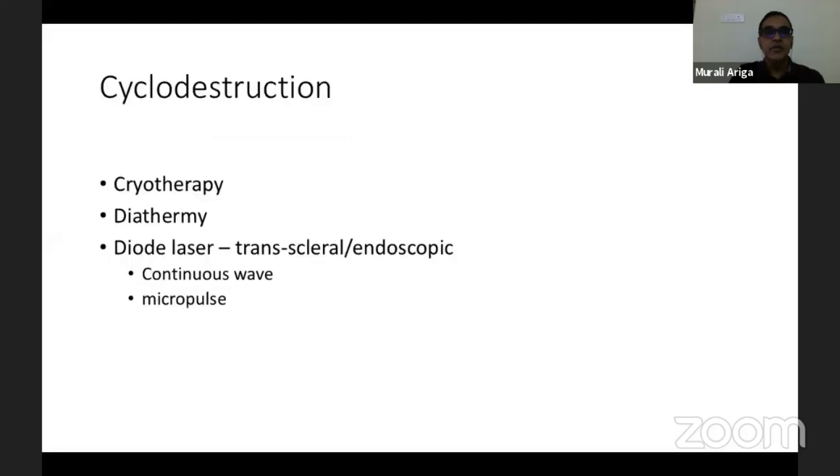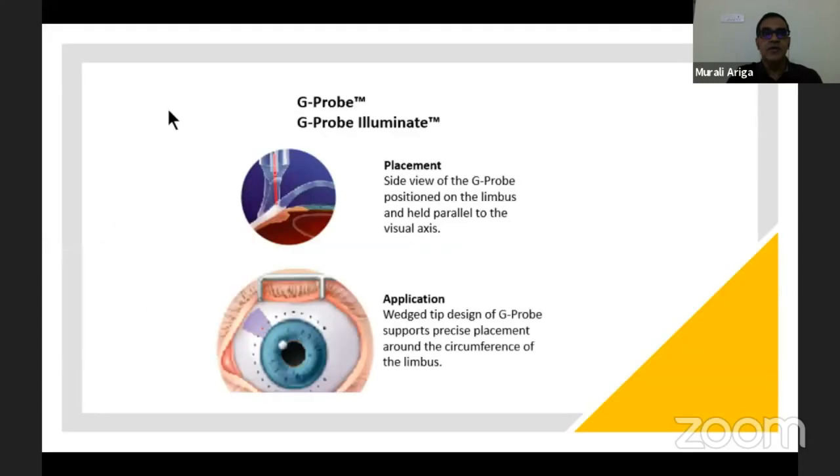We were doing cryotherapy in the past. We were doing diathermy in the past. And then we moved on to the diode laser, the continuous wave diode laser. For quite some time, we've been using the diode laser. And now, as a recent addition to our armamentarium, we have the micropulse diode laser.